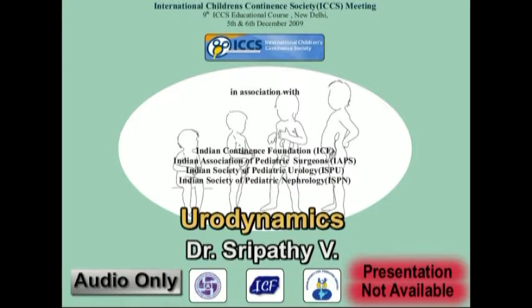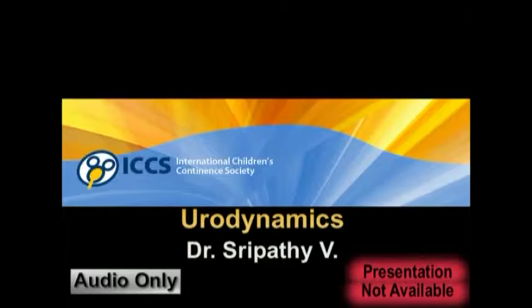It is often used to decide whether invasive urodynamics is warranted, and of course it can be repeated to assess the effective treatment. So before, during, and after Uroflow, there are a number of things that need to be done. This is often neglected. You have to maintain a frequency volume chart for 7 days if possible, but if both parents are working, I find even 48 hours is difficult to do. You must ask the child to drink a little bit of water before the study. The child should be old enough, I think Dr.